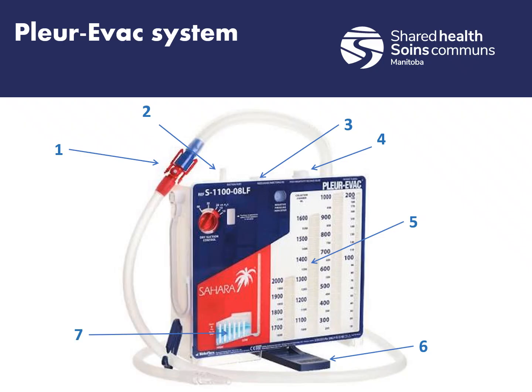Next thing we have is the dry seal and patient air leak meter. Like I said before, this may have fluid, it may not. You can just ask when you pick up the patient, if there's no fluid, why they're not using it. It's not wrong. It doesn't have to have the fluid in there, but we do put fluid in there to help look for any air leaks by watching for bubbling. And again, this is why we would put that 20 mLs into this device.